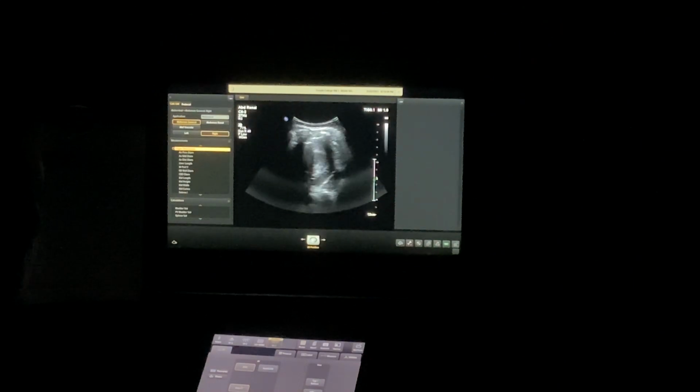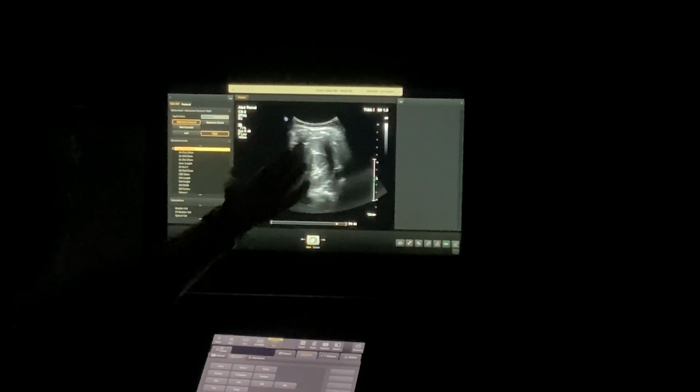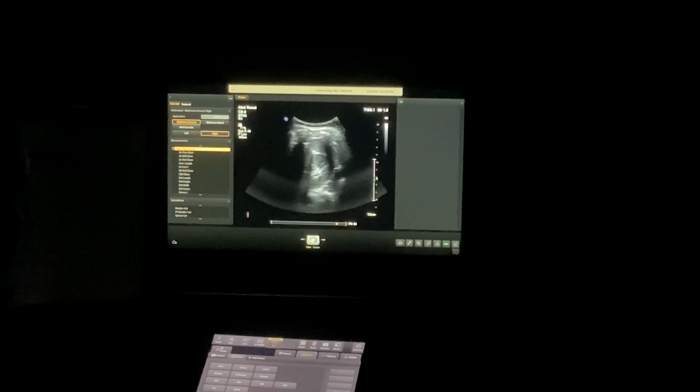Now, if that shadow was right here, can I take that for a mid measurement? No. Please, for the love of God, don't take this as a measurement if you can help it. Why can't I take that for a measurement? You can't see the edges. I can't see my edges. I can't even really tell if that's mid, because I don't see vessels, I don't see a hilum, and my edge is obscured for my width measurement. Okay?